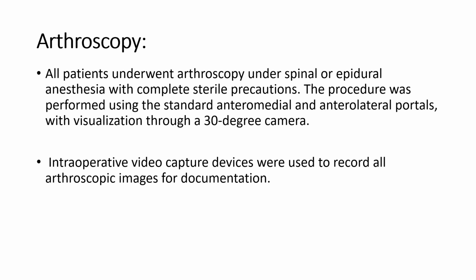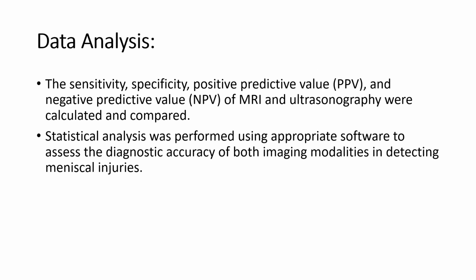Then arthroscopy was performed under spinal or epidural anesthesia with complete sterile precautions. The procedure was performed using standard anteromedial and anterolateral portals with visualization by a 30-degree camera, and intraoperative video capture devices were used to record all the arthroscopic images for documentation. And then data analysis was performed. Sensitivity, specificity, positive predictive value, that is PPV, and negative predictive value, that is NPV, of MRI and ultrasonography were calculated and compared, and statistical analysis was then performed using appropriate software.